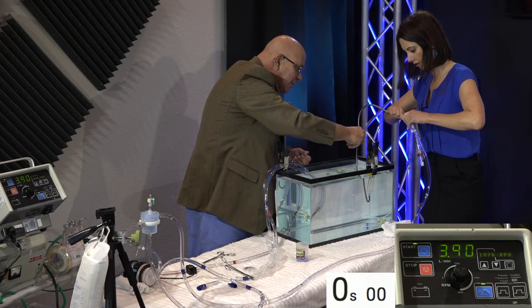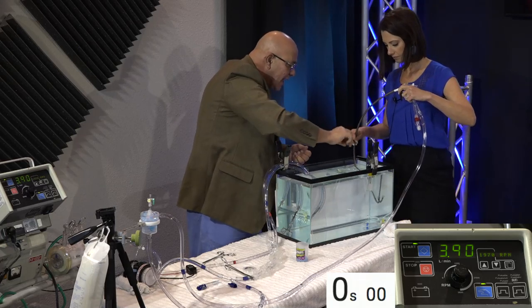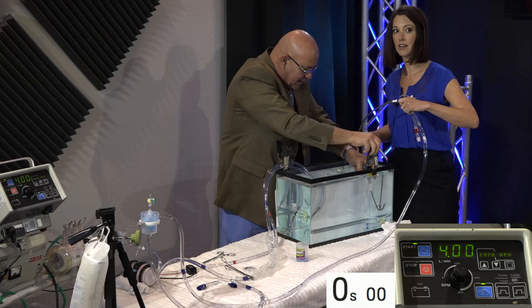All right. And this time, come up with it like this. Don't go at such an angle. Try to come straight up. We'll just try it and see.